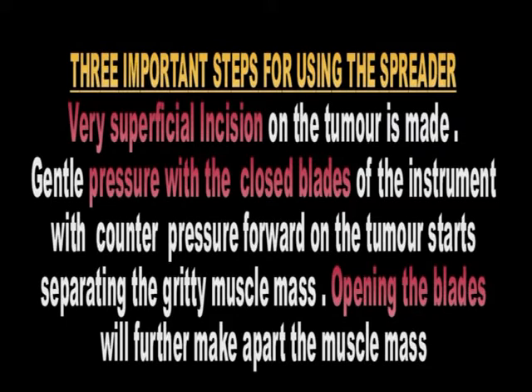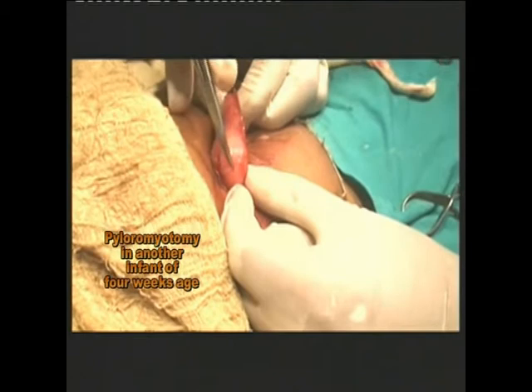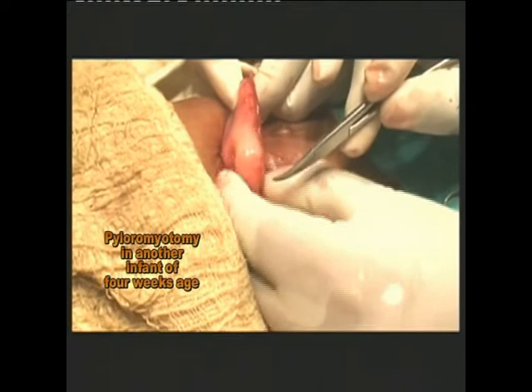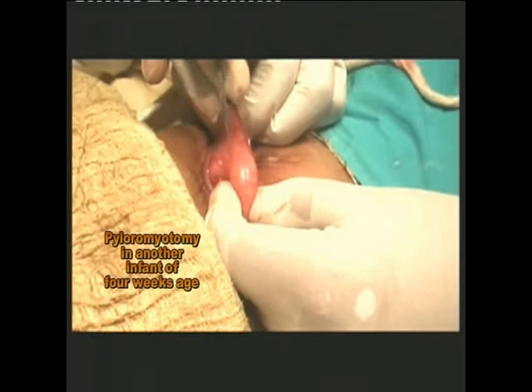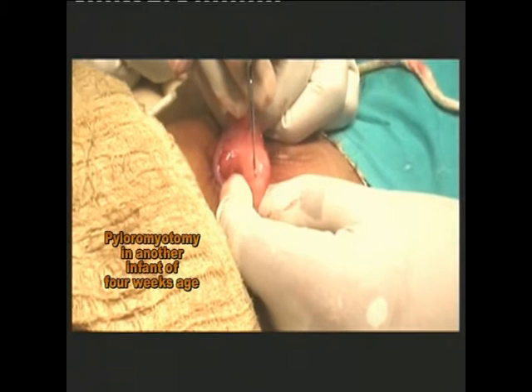This is the white line, prepyloric vein, tumor, stomach side, and the duodenum. Here is the duodenum. So, incision. This is the prepyloric vein. Start here, gradually made deep.